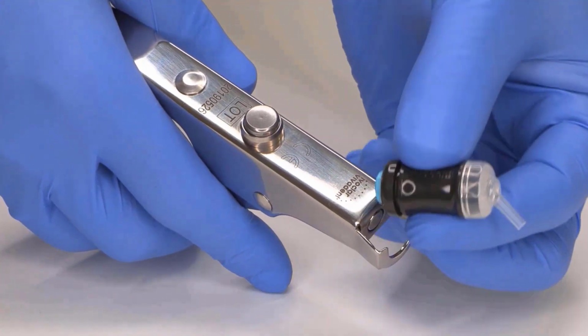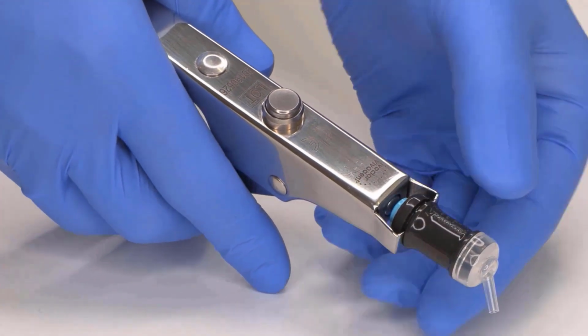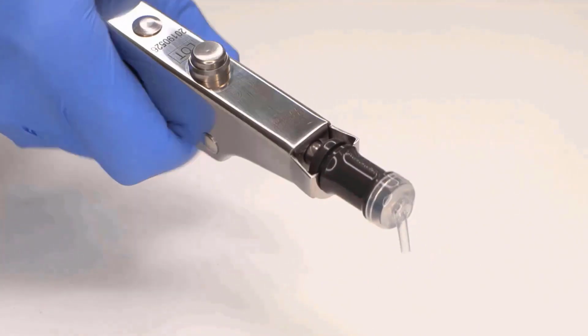Once the material is mixed, immediately insert the capsule into the applicator. Click down on the lever of the applicator several times until the material is visible at the transparent tip of the capsule.